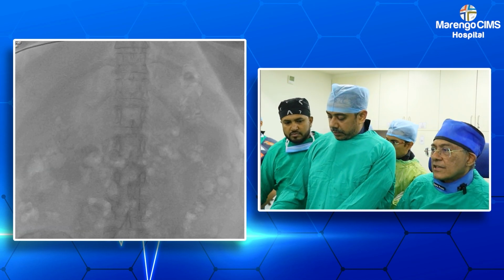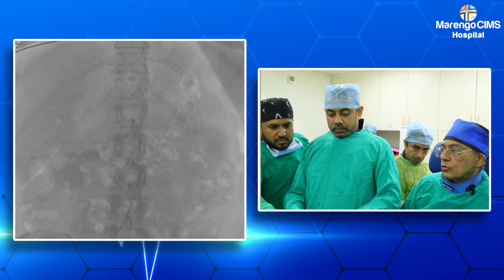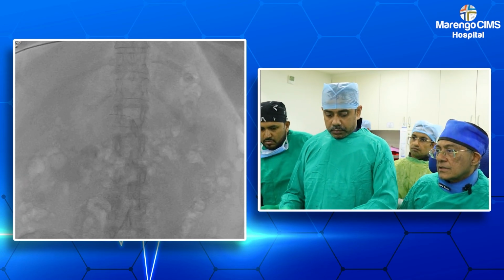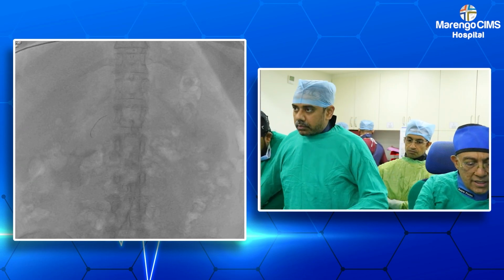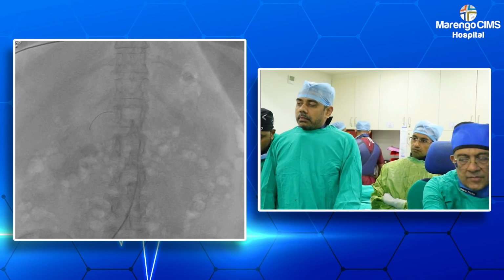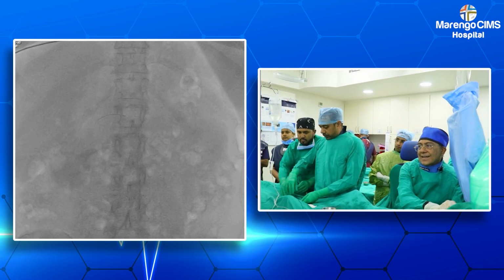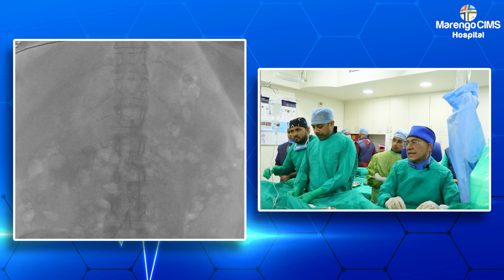The present catheter is about 115 centimeter long, so it cannot be used through radial access through conventional radial Judkins catheters, which are usually 125 centimeter long. Company is working into developing longer catheters. So we'll be using the renal direct catheter in this case.